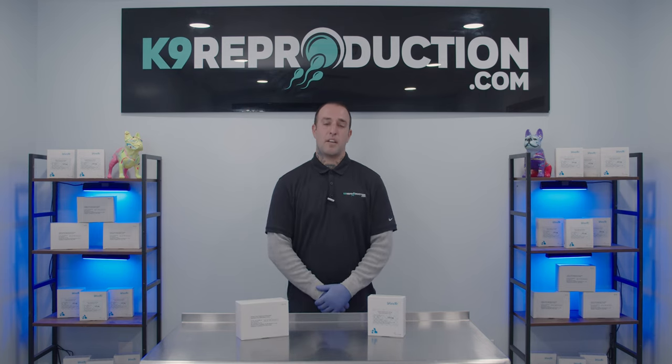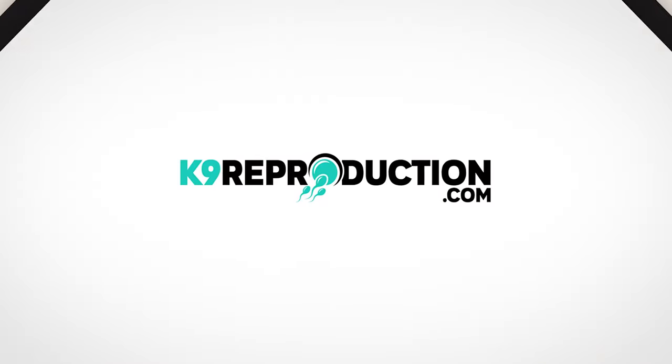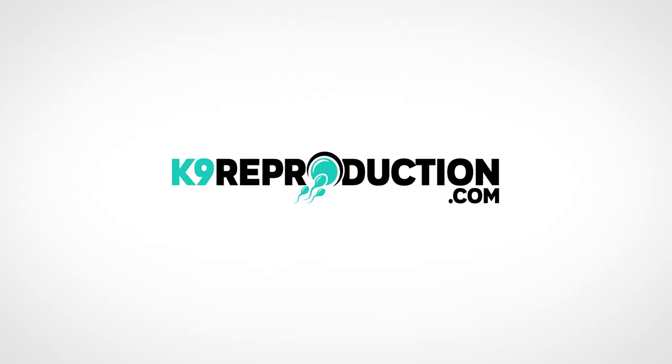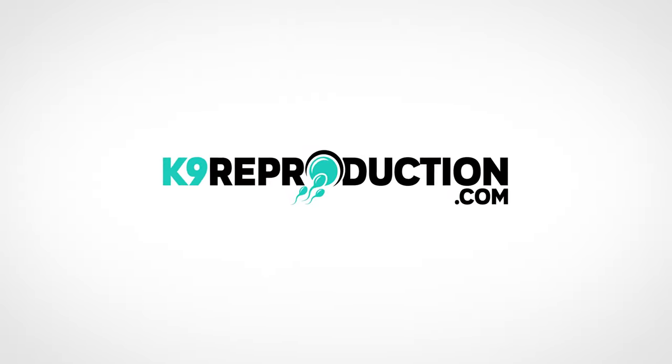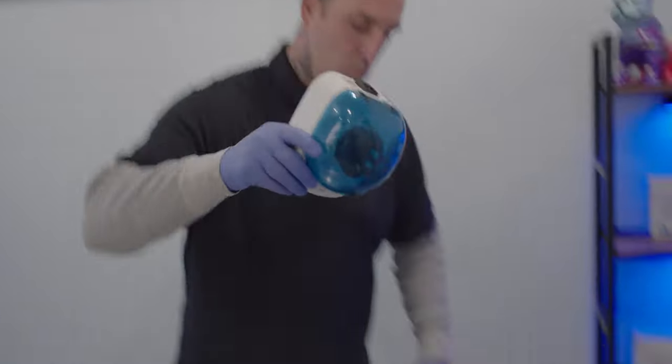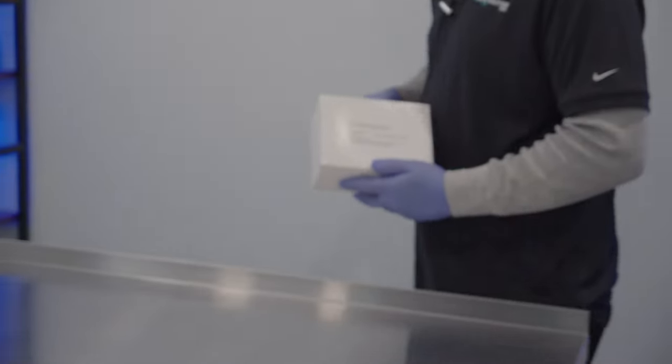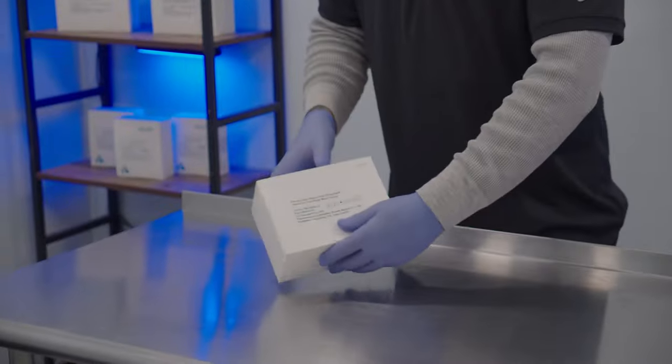Hey guys, this is Travis with K9Reproduction.com and today we're going to talk about WANFO whole blood tests and machine bundles. WANFO now offers a whole blood test option for your WANFO fine care vet machine. This means that you no longer have to centrifuge down your blood samples in order to run a test. Now you can ditch the centrifuge and put whole blood directly onto your test strips.